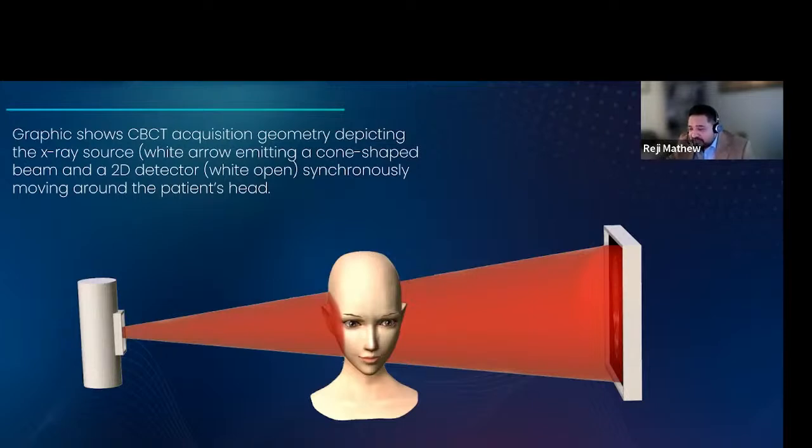We have something called 3D printed brackets. Now orthodontic 3D printed brackets are there. The aligner industry is exploding. So there are a lot of changes happening in dentistry. Most of the dental side is moving very fast into digital dentistry. Digital dentistry is in a catching up phase, and I think probably in 1 or 2 years, I mean, it's already there, it would be mostly all digital dentistry rather than what probably some of our older generation might have learned.